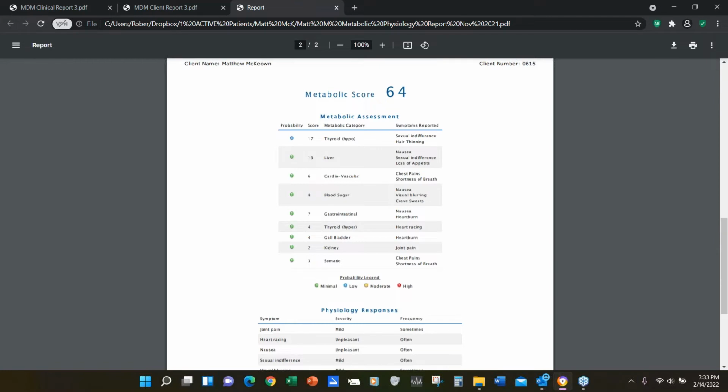You can be really minimalist about it too. You can just say, look, this is just looking at your symptoms and how they may be related to different functional areas in your body. And what we're doing is we're scoring you, because if your score is really high, that's going to interfere with the neurofeedback. Right. And because we have this, we can tell if you have so many symptoms, we can tell if it's going to interfere with the neurofeedback.